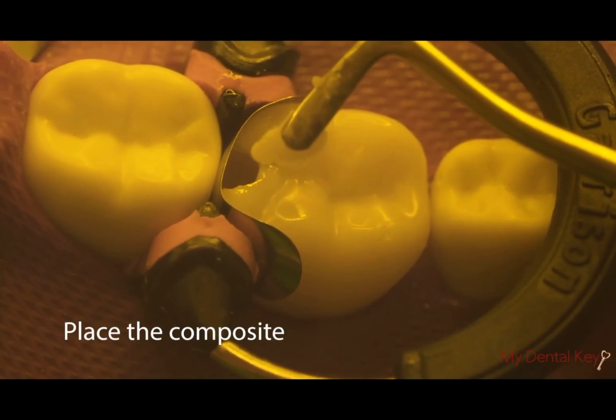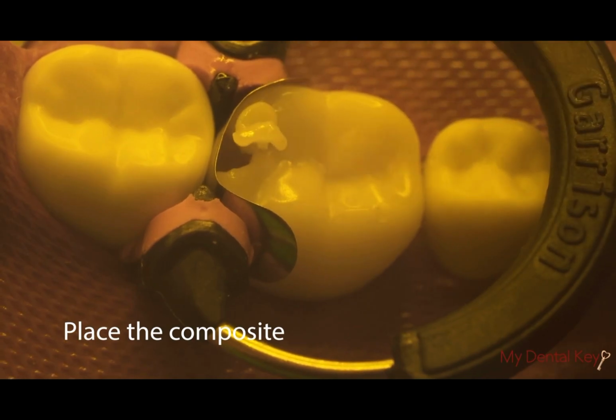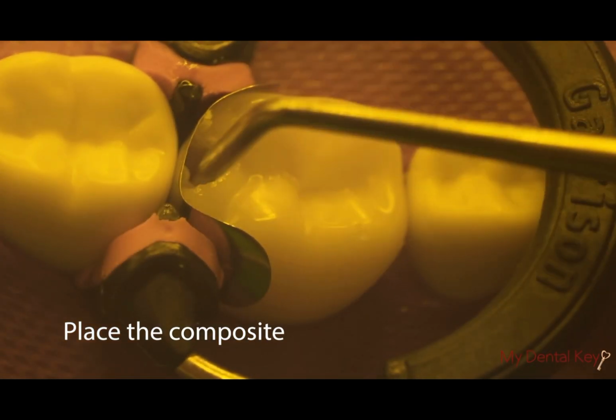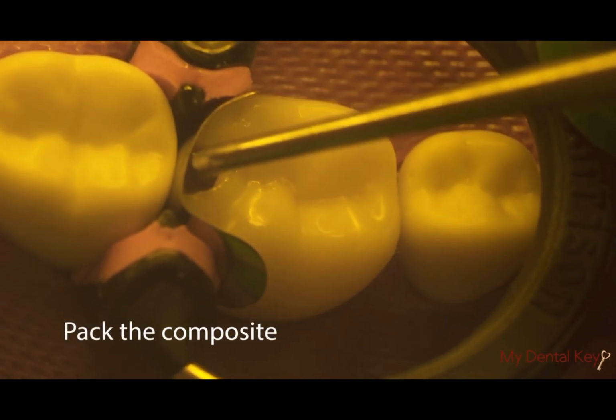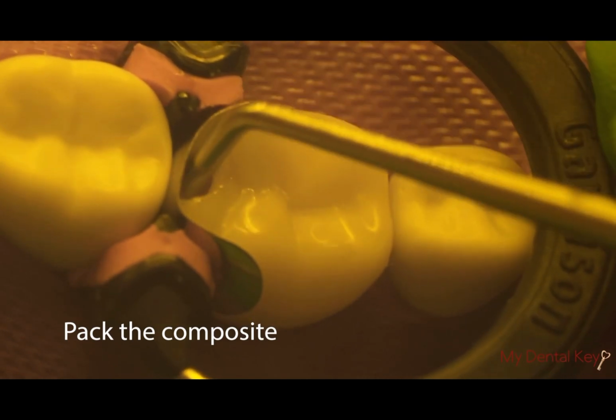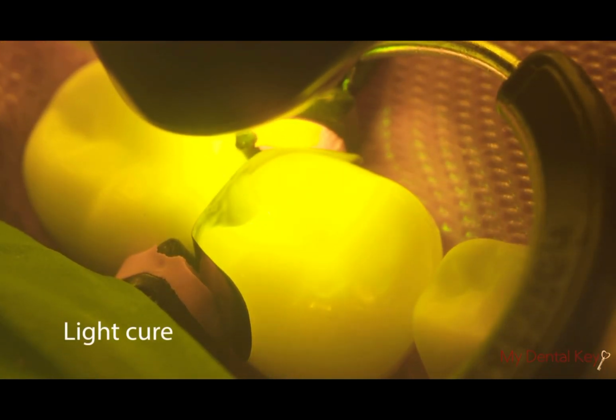Place composite into the most gingival portion of the preparation, starting at the gingival wall of the proximal box. Note that your increment should be no more than 2 millimeters thick. Use the smallest composite plugger to pack the composite and ensure it is flush with the preparation walls and matrix band. Though not shown in this video, during the first few increments of composite, to ensure appropriate gingival seal and good adaptation to the adjacent tooth with composite placement, push your composite plugger toward the adjacent tooth. Light cure the composite for 20 to 40 seconds.